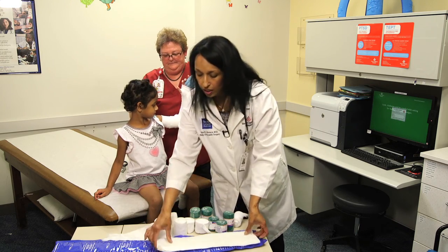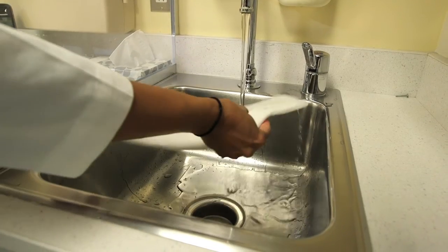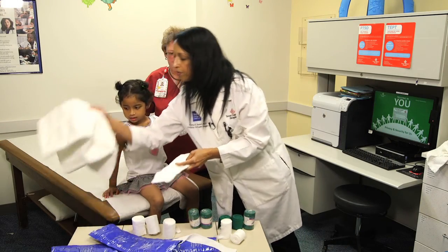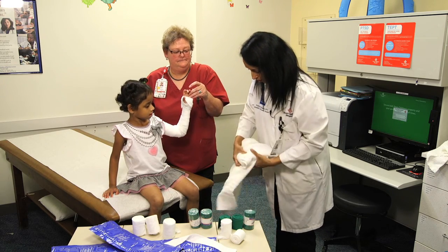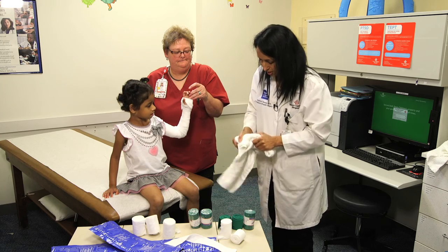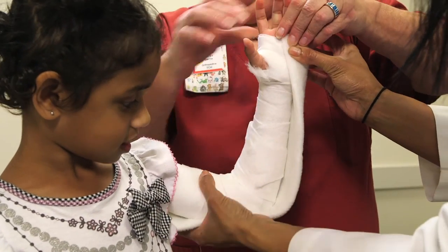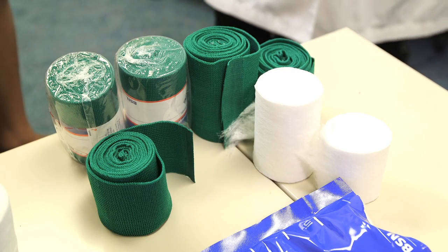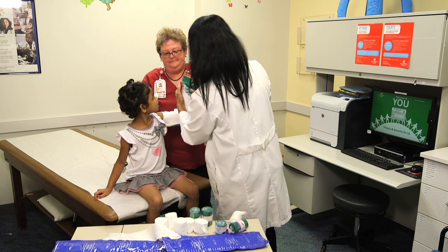Once you have adequate padding and no bony prominences, get your splinting material wet, then wring it out with a towel. Once it's nice and wet but not saturated, you can lay it against the patient's arm. When wrapping, we typically use ace wraps, and again you want a fit that's not too tight but not too loose.